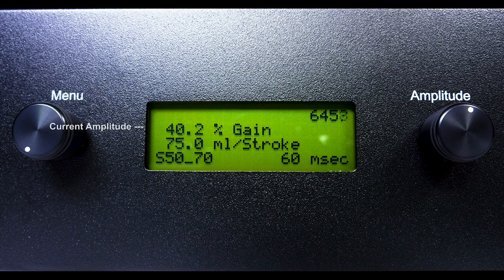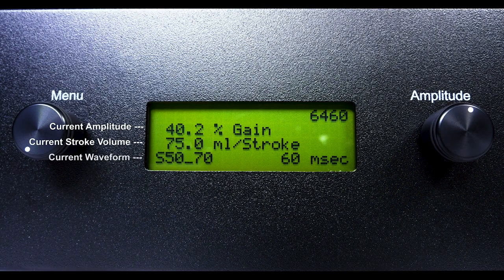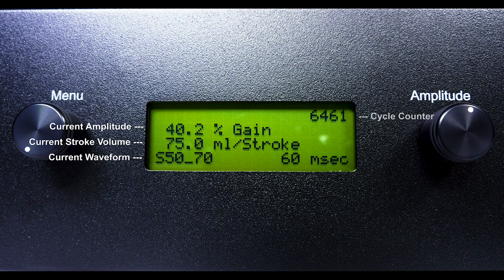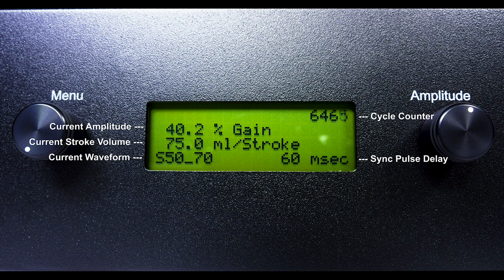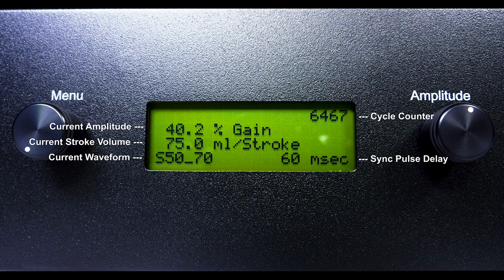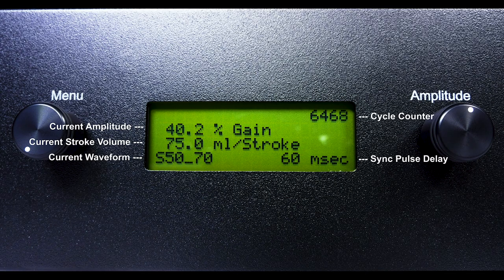During operation, the controller screen displays the amplitude percentage, stroke volume in milliliters per stroke, selected waveform, cycle count, and sync pulse delay.